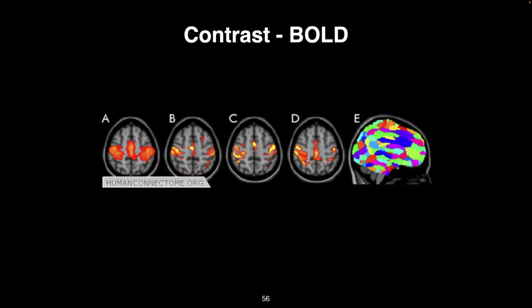You mentioned the changes that were occurring in brain tissue, but in the diagram, the magnetic field was changing intravascularly as well. Yes. So the comment was that I spoke about the field changing in the brain tissue, whereas the diagram showed intravascular effects of the field.